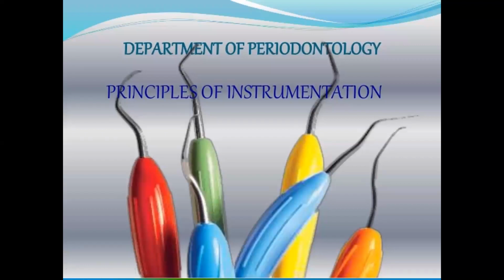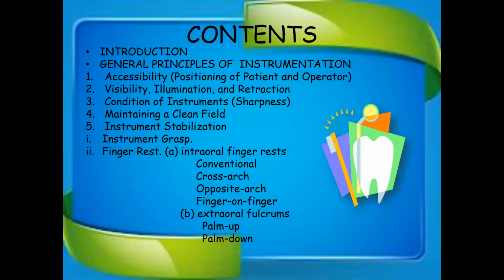Good morning everyone. This lecture video will be a combination of your lecture presentation on the principles of instrumentation, and there will be 3 demonstration videos. These are the contents of this lecture.